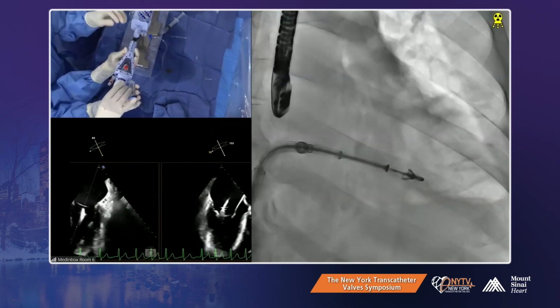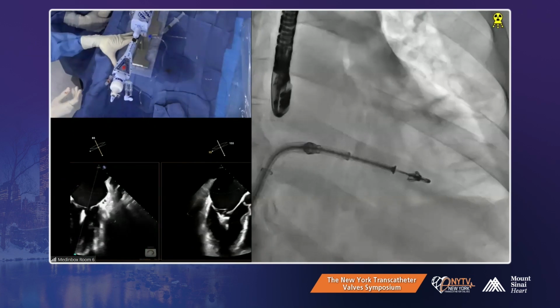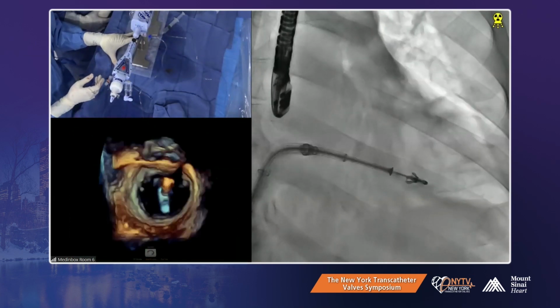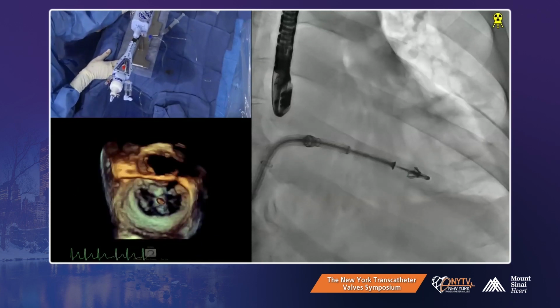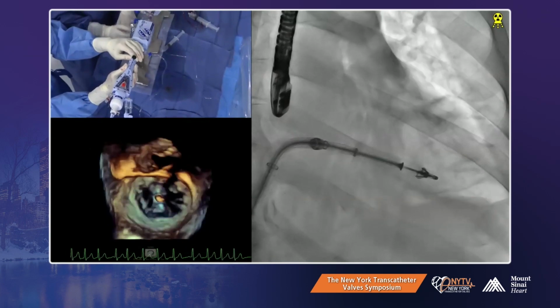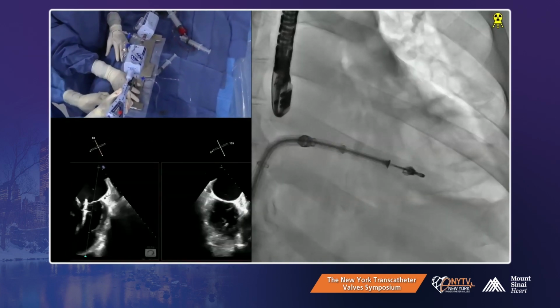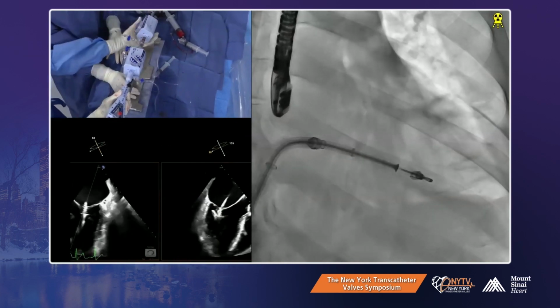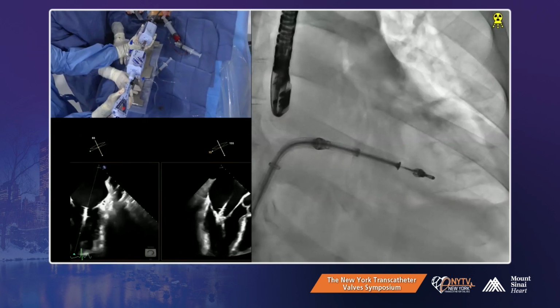Let's just check the posterior orientation one more time. Do you think you grabbed a cord on the way up? Yeah, let's just check orientation. I don't think so. It has been curling. No, we are now in the center. Let's go lateral. Center, yeah. Okay, all right, that looks pretty good, guys. Everyone agree? Yes.